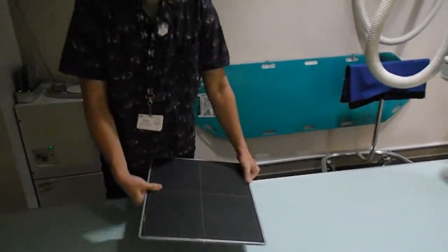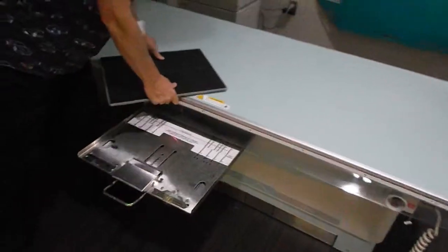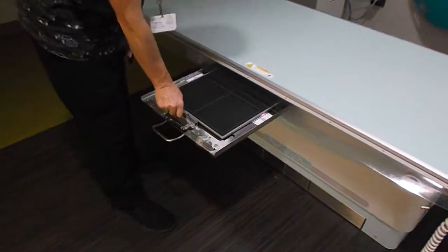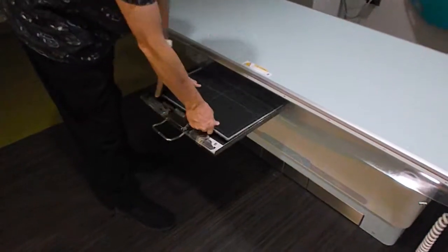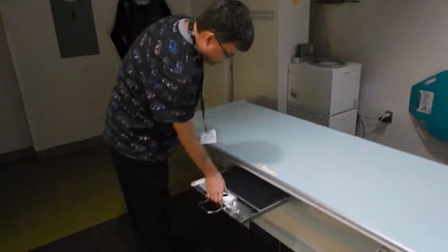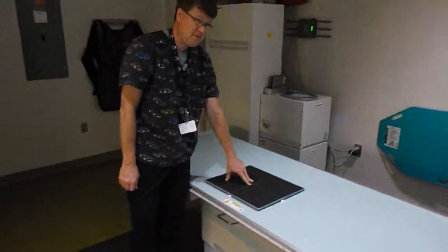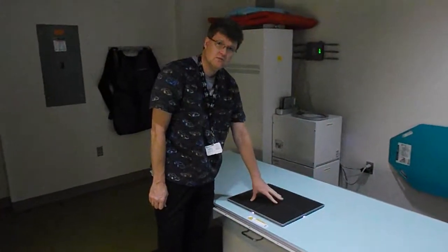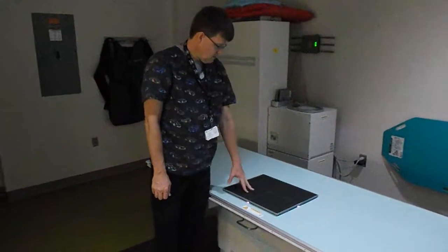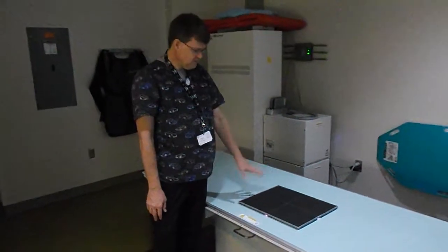This one we will use for tabletop or also in the table bucky. You will have to handle it, but you've just got to handle it carefully — keep two hands on it at all times, depending on what type of picture you're taking. How is the weight of that compared to the old Fuji cassettes? These ones are about half the weight — they are a lot lighter, and yet they are twice as strong. These have about a 500-pound weight limit with a 250-pound pressure point. The old ones, it probably would have messed up pretty easily. But these ones are twice as strong and half the weight.